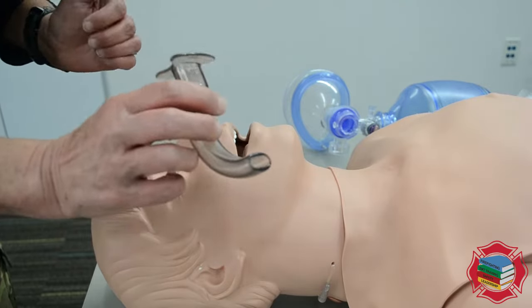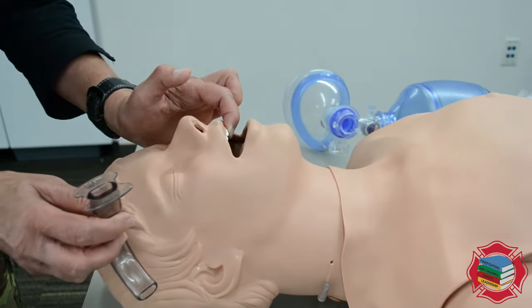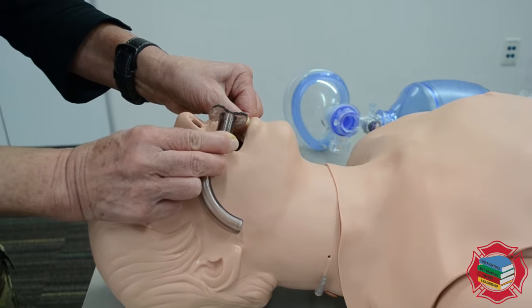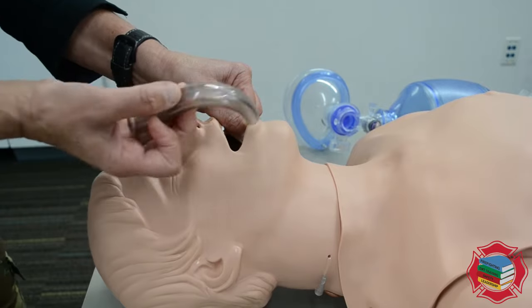I'm going to take my OPA — oral pharyngeal airway. This is an unresponsive patient, probably without a gag reflex, but I don't really know that at this time. I'm going to open the mouth with my cross-finger technique — thumb over index — and measure from the front teeth to the angle of the jaw. The corner of the mouth to the tragus of the ear is also acceptable.